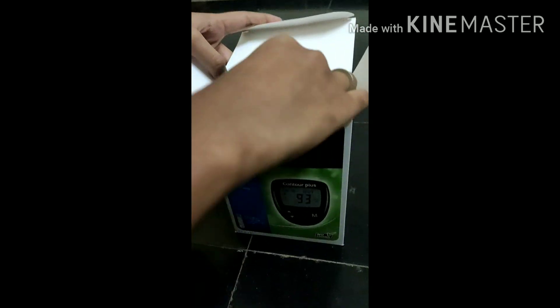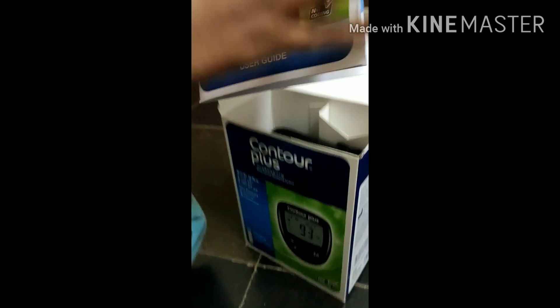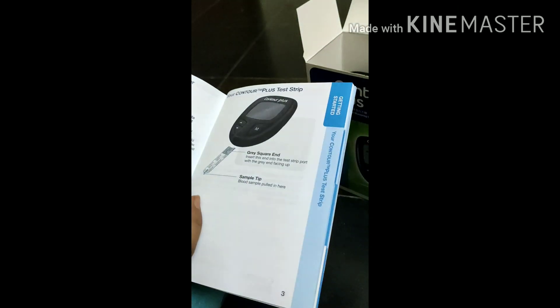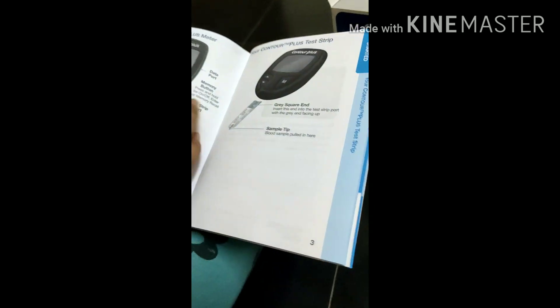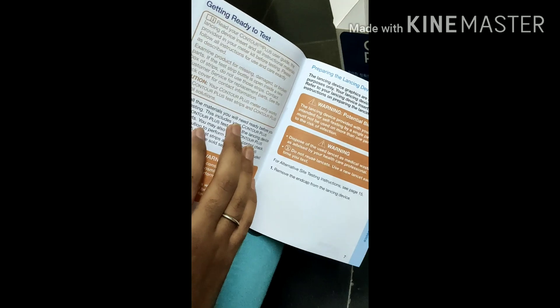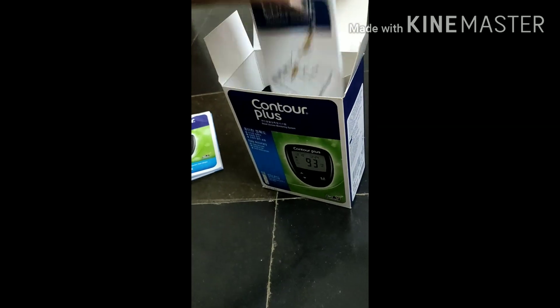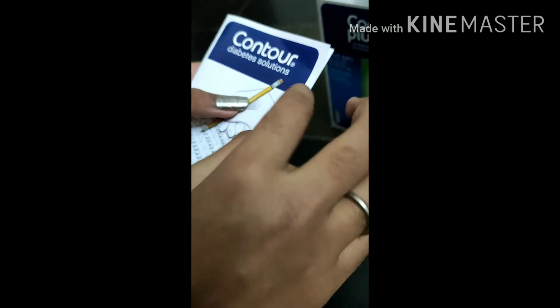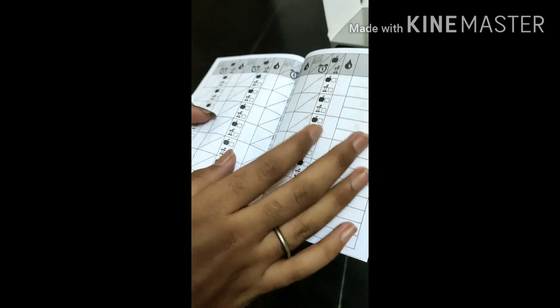Here we go. You can see we have a user guide — you can see how to use, how to keep, and how to control the device. Next, you have a diabetic solution log where you can write your results and maintain a record.